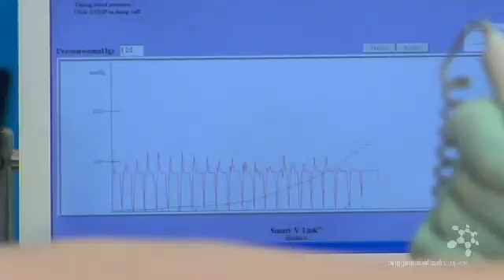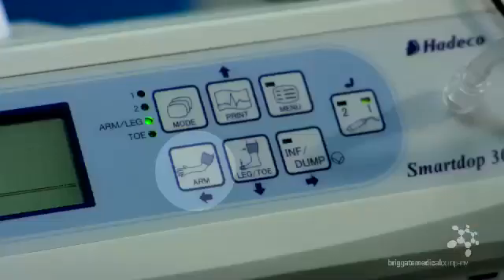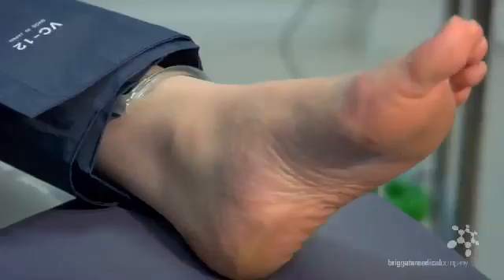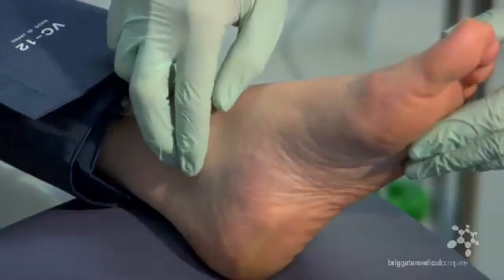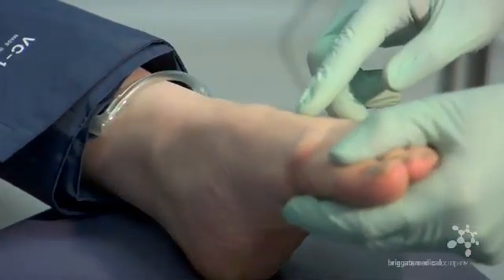Once the systolic pressure is determined, the probe can be removed and the arm brachial pressure stored by pressing the arm-leg button on the Doppler or clicking the decision icon on the screen of your computer. We can then repeat this procedure at the ankle site from either the posterior tibial or the dorsalis pedis arterial sites.